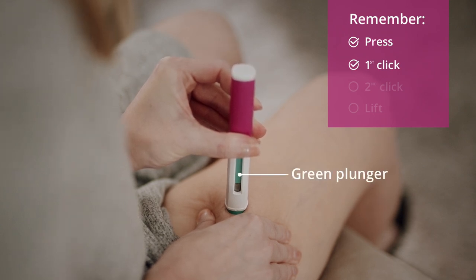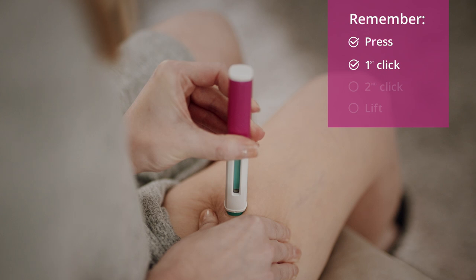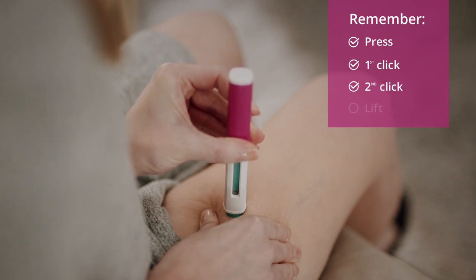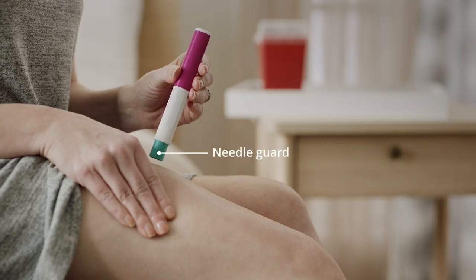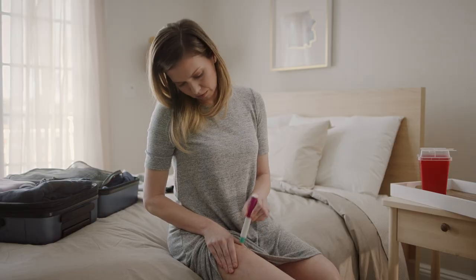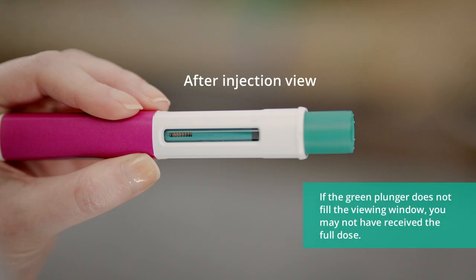The green plunger will start to fill the viewing window. Hold the Fasenra pen in place for 15 seconds and do not change the position of the pen. You will hear a second click that signals that the injection has finished. The green plunger will also have filled the viewing window, which is an indicator that all the medicine has been injected. Lift the Fasenra pen straight up. The needle guard will slide down and lock into place. Check the viewing window to make sure all of the liquid has been injected. It should look like this. If it doesn't, call your health care provider.